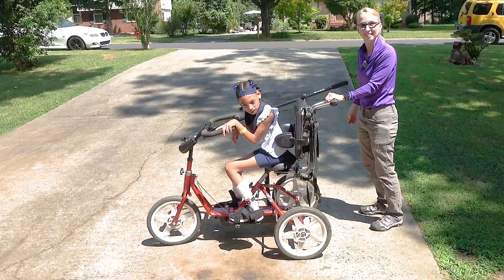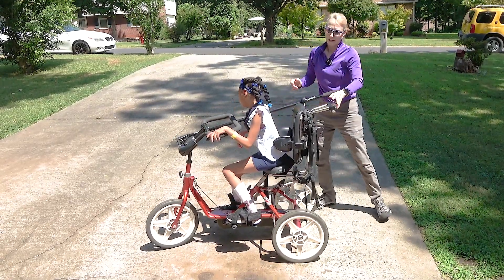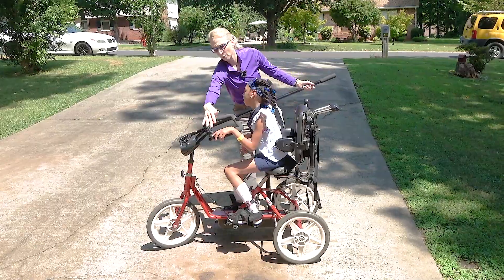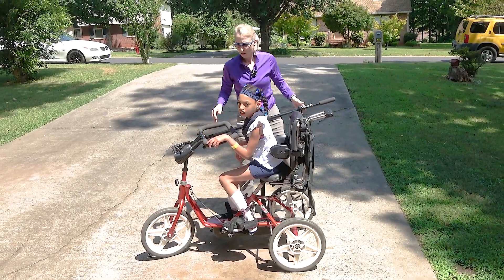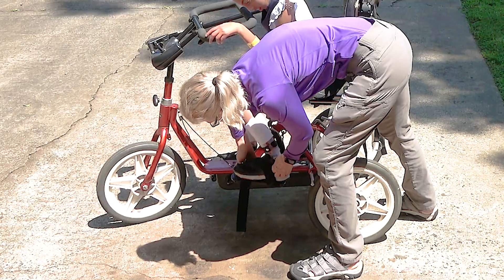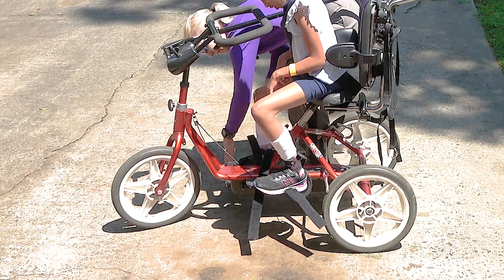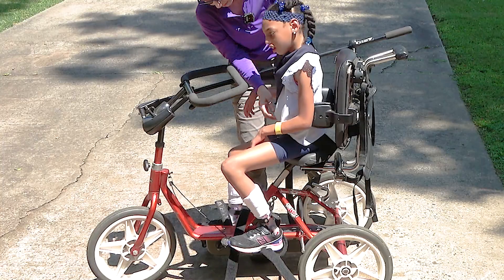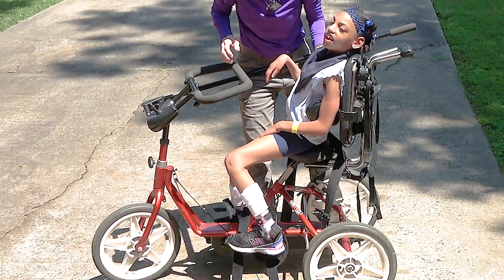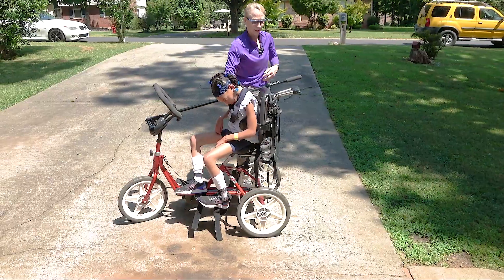Alexis loves it too. To get a child in and out, you can just put on the brake, which is really nice. And if you need to flip this up out of the way, you can flip it out of the way if you have to go to one side or the other. This can attach going to either side of the tricycle, but to get her out, the easiest way is to undo the feet. I have nice straps to hold the feet down, so a lot of my kids cannot maintain their feet on there without assistance. And you undo the seat belt. She does not wear the chest harness — we could undo the chest harness if she had it on. One of the things you can do is loosen up the handlebar and flip it up out of the way, so it makes it just a little bit easier to step in and out.